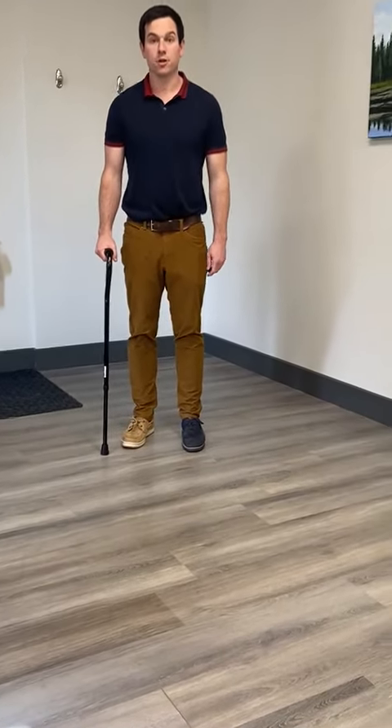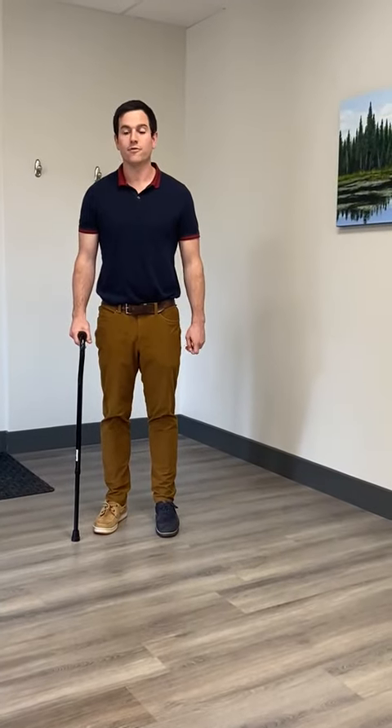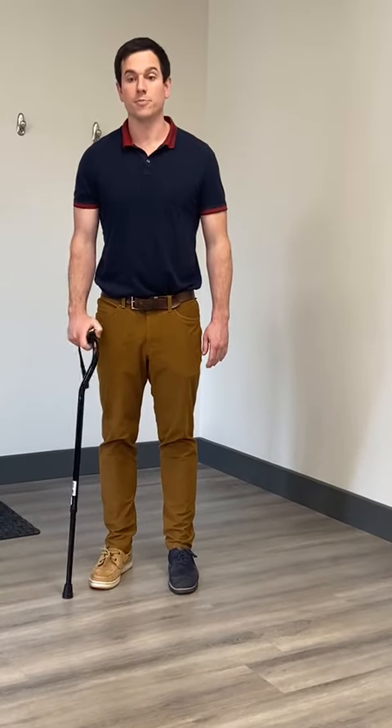Take your first step slow and this should give you a good start. If you're having any issues, you should work with your physiotherapist or doctor to make sure you're using the cane correctly.